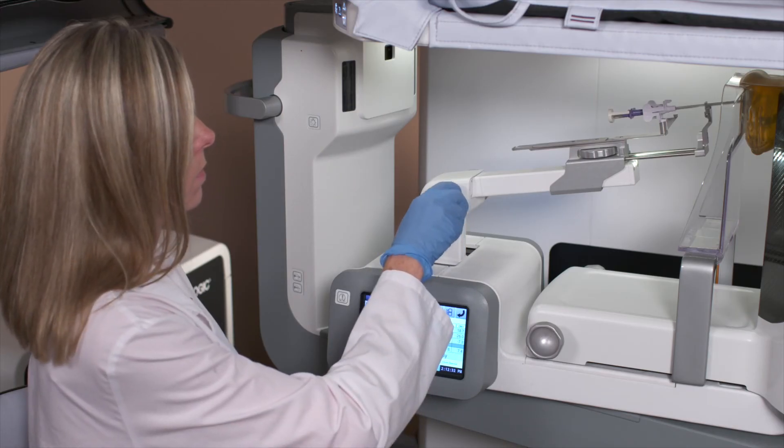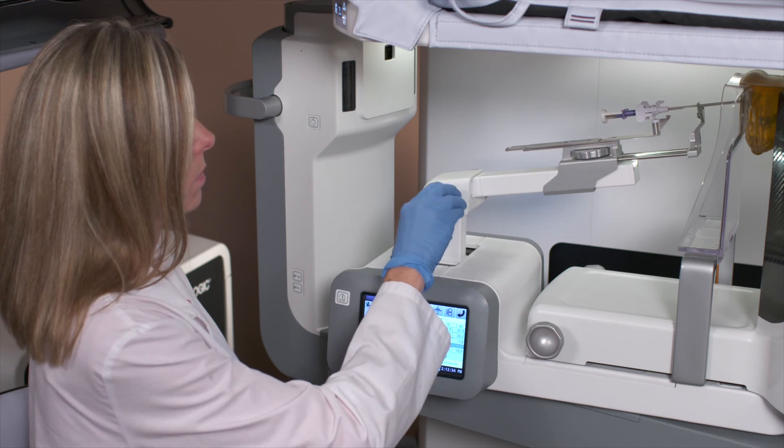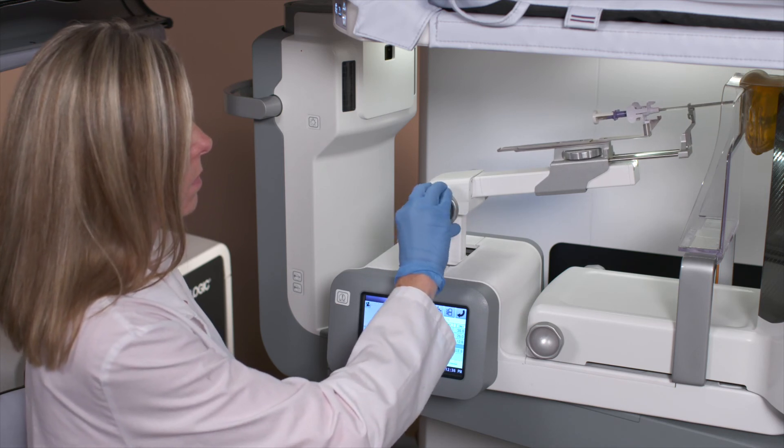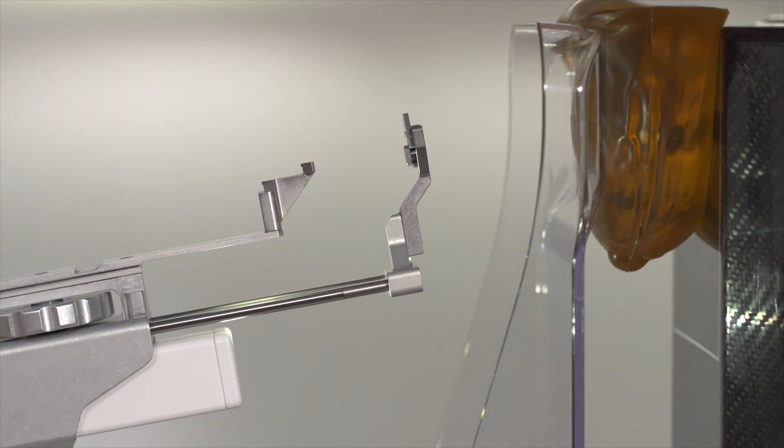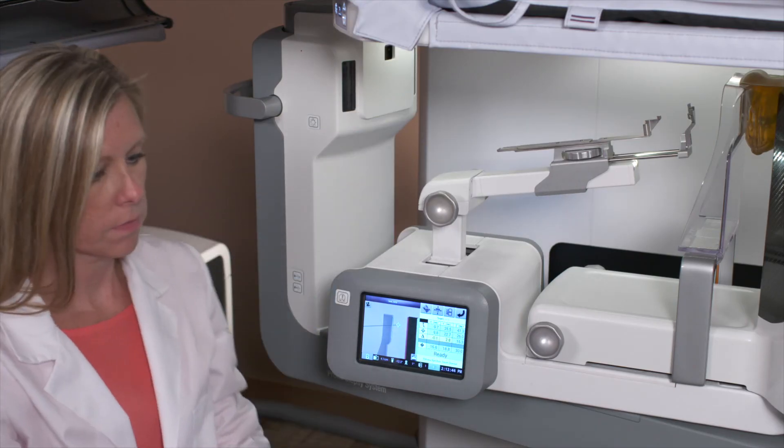Once confirmed, the introducer and marker deployment system are removed from the patient's breast together. Dial the introducer and marker deployment device out of the breast as one unit.